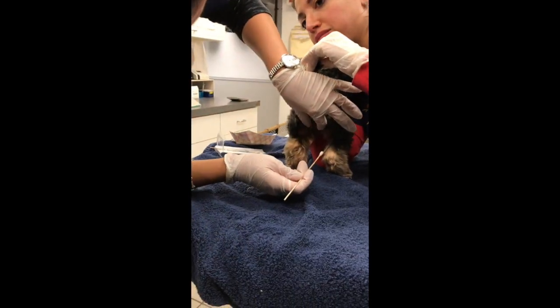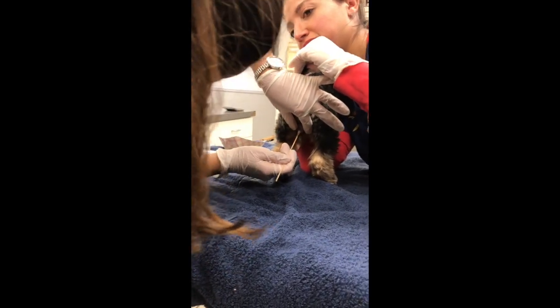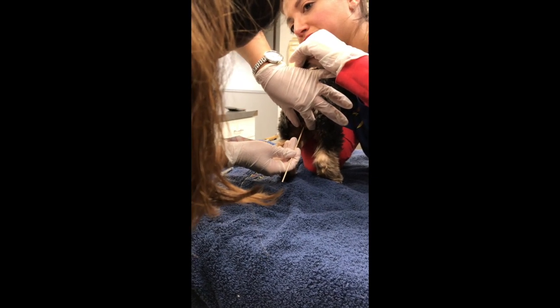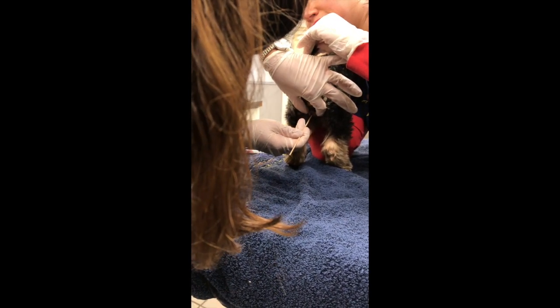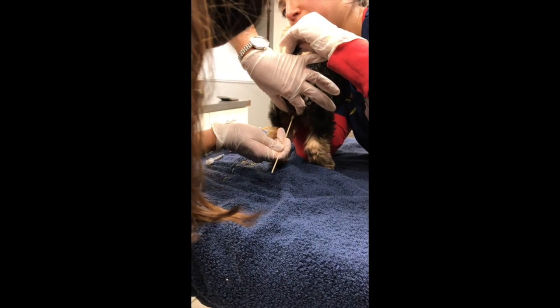First I'm going to part the vulva lips. There we go. Oh, you're a good dog. There we go, just like that. Good work. Now I'm just going to swab it. Now we have our sample.